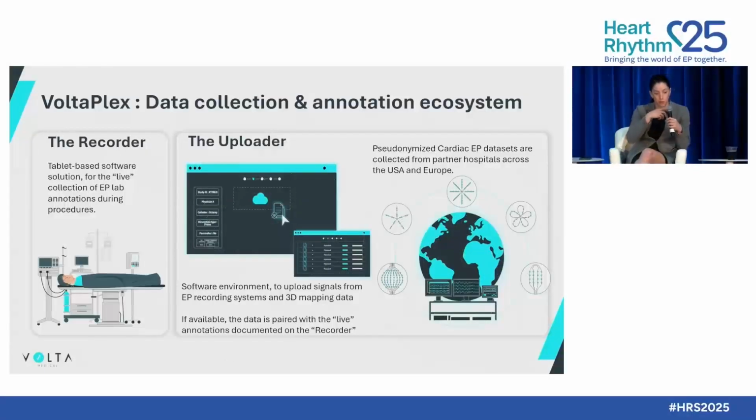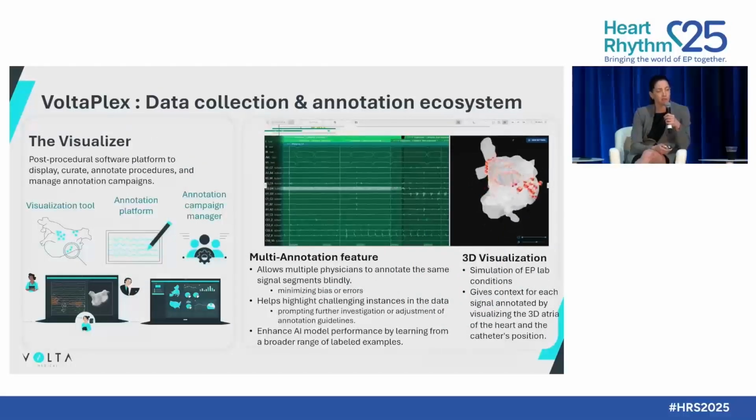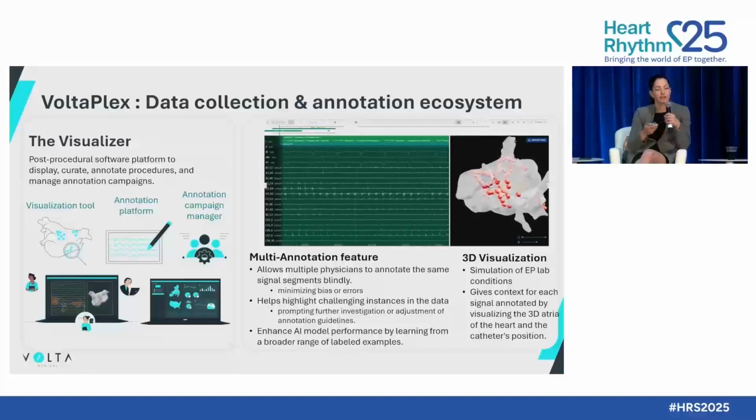And then there's an uploader, a different software environment that not only uploads the signals and your annotations, but also the 3D mapping system data. And of course, this is if your center is collaborating with the larger group to help them teach the Volta model. The visualizer, on the other hand, is what you have at the very end.